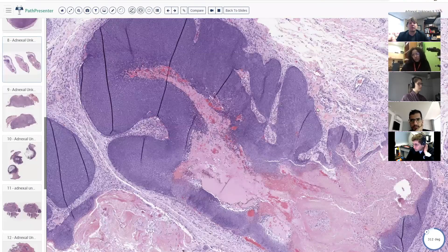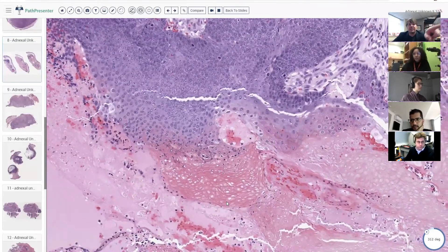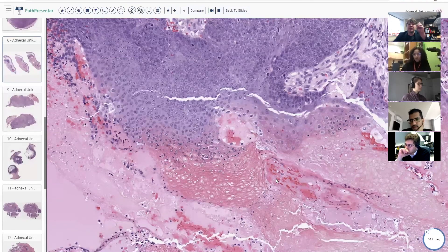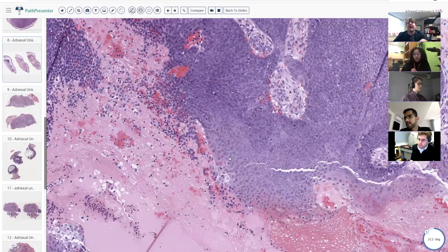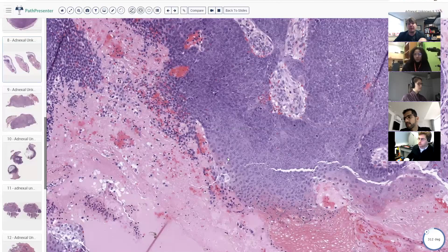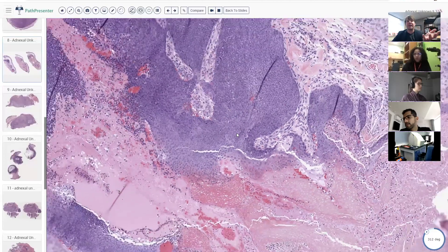As a general tip: if I see something and right away think it looks like pilomatricoma, almost always it ends up being pilomatricoma regardless of mitoses. When I've seen matrical carcinomas, those cases I look at and say this looks like an ugly carcinoma — and then I start seeing areas of transition to ghost cells focally, or some trichohyalin granules, those little red granules you see in the inner root sheath of a normal hair follicle. Usually I start at cancer and then after the fact realize there's a matrical component.